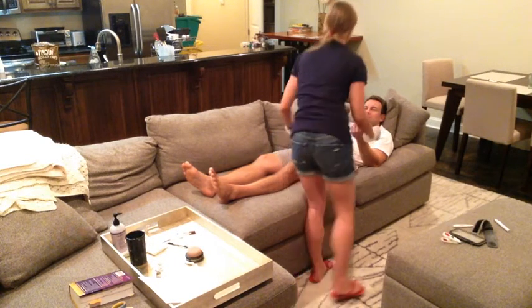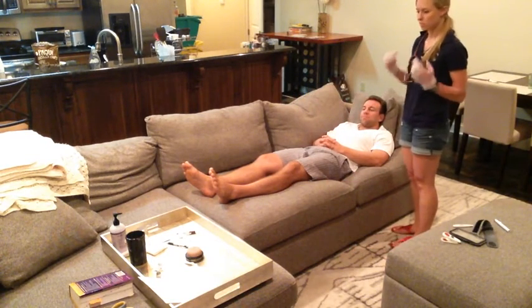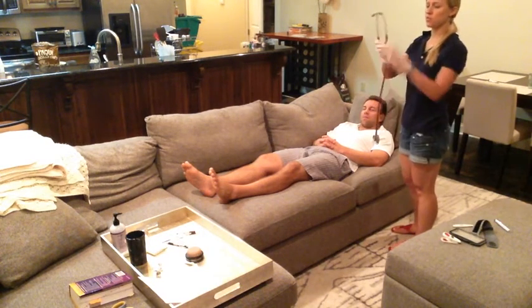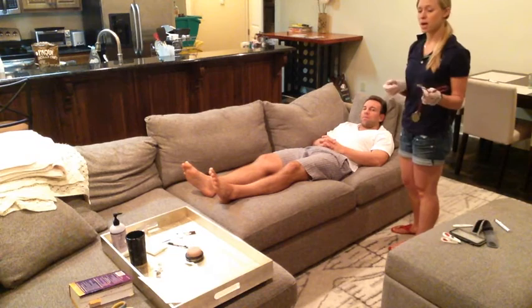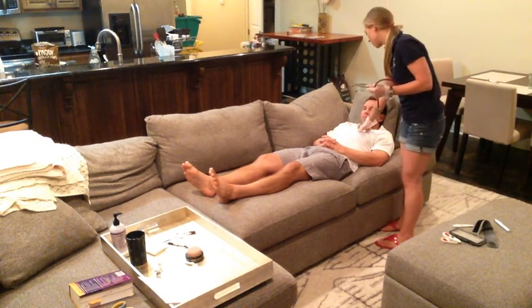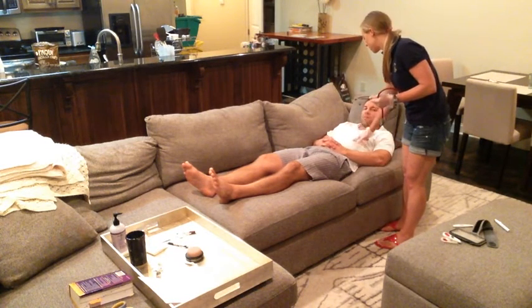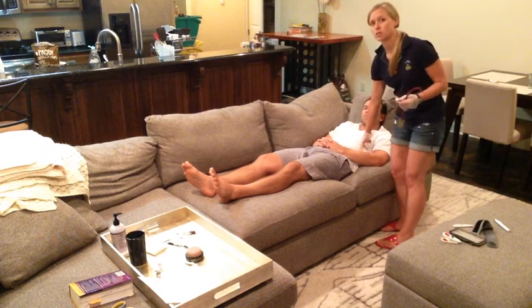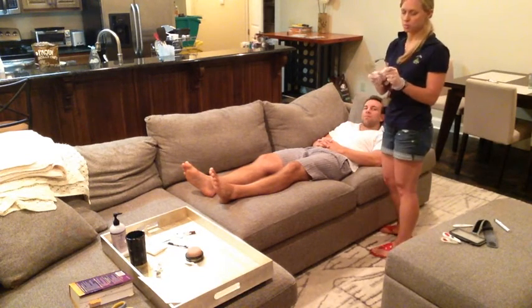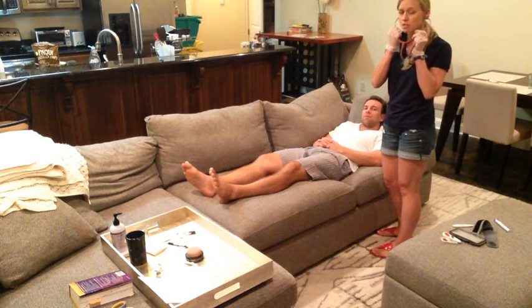All right, great. Next we're going to assess the heart. So I would find the PMI, or the apical pulse, which would be found by finding the 5th intercostal space, and then left midclavicular line. We're going to let my patient keep his shirt on, but that's where we would be looking. And then I would auscultate the pulse. I would listen for a full minute.